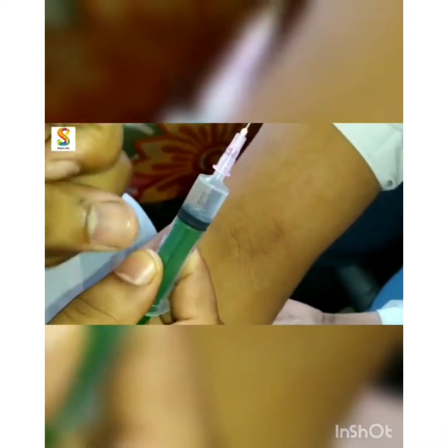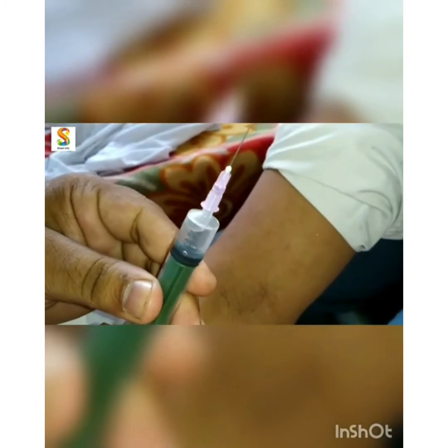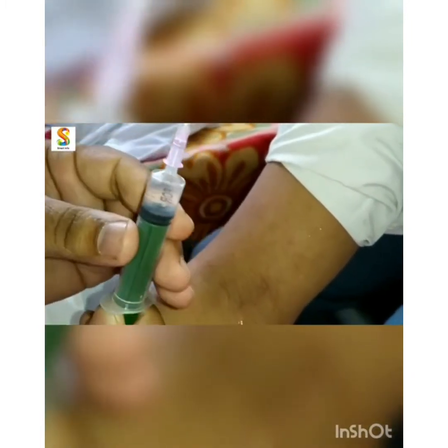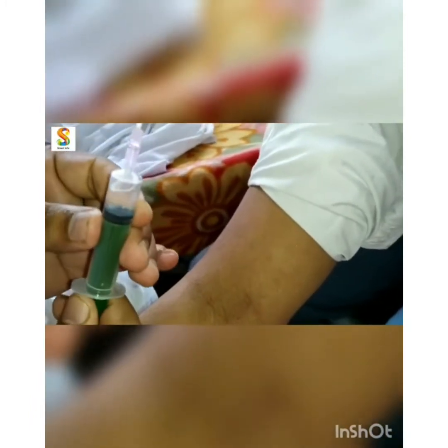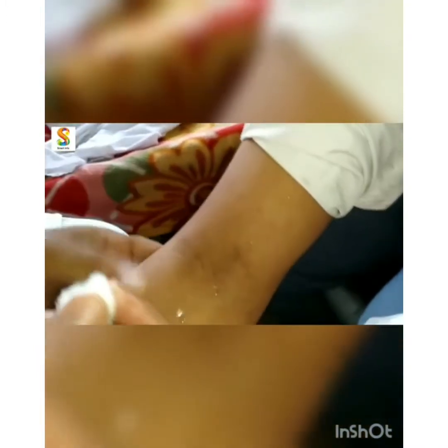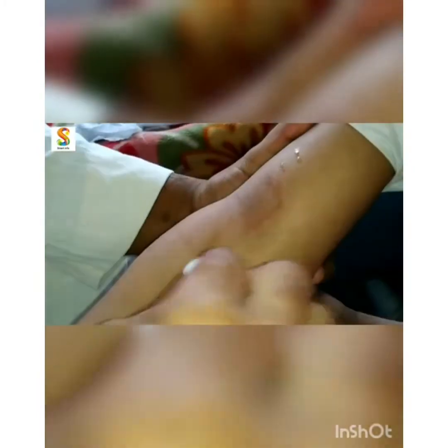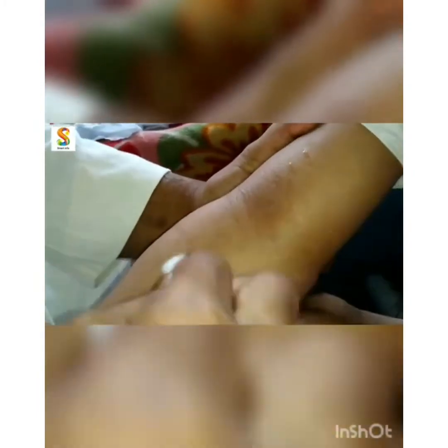Before this, you can see there is an air bubble inside the syringe. We first need to remove that air bubble like this, so that we make sure that there is no air bubble inside the syringe. You can see there are air bubbles. Let's try to remove that. Then we need to clean the surface with the help of an alcohol swab. That's usually an antibacterial alcohol swab, and we should let it dry. We should not use anything; we should let it dry by itself.